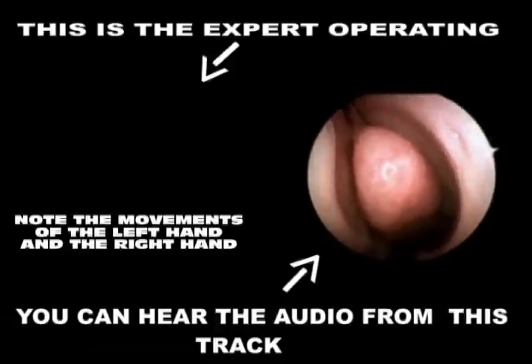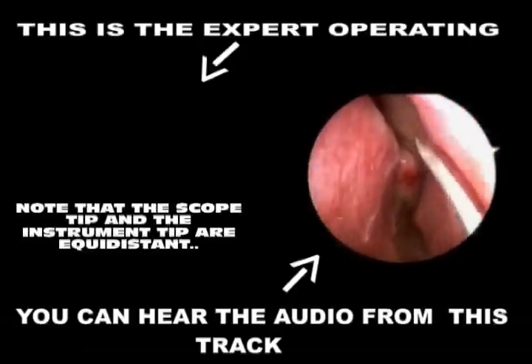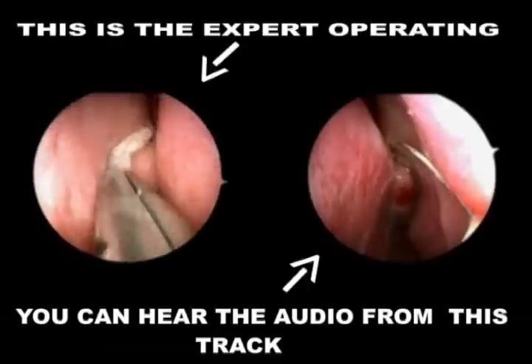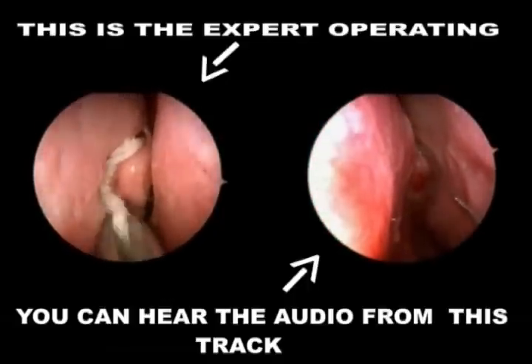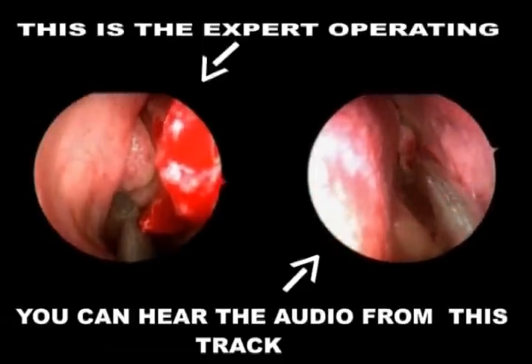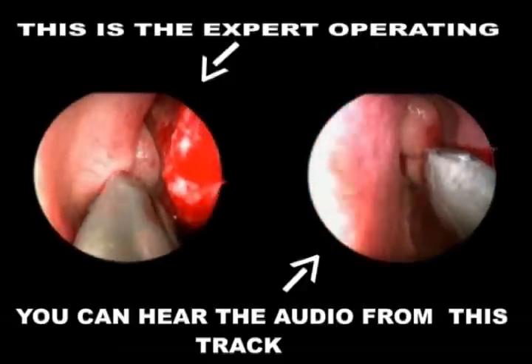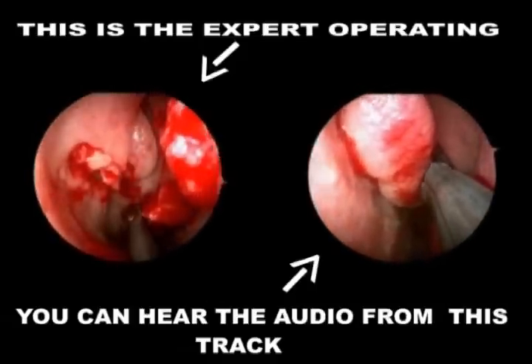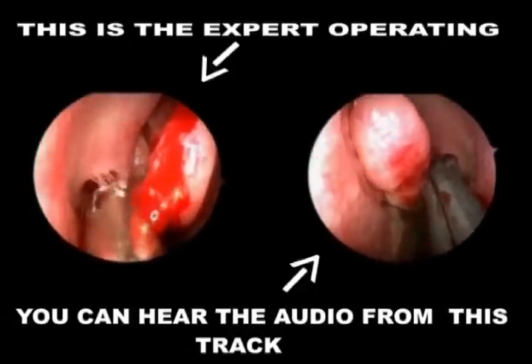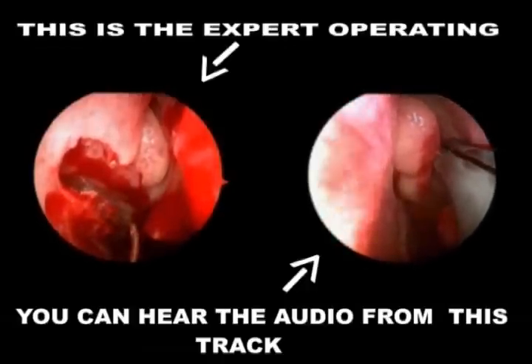Here is a first surgeon who has done just 20 middle meatal antrostomies. You can see the scope tip did not advance with the instrument. Now you can see the same surgeon infiltrating the nose — his right hand is wobbling, the left hand is also not steady and is far anterior. The left hand is not advancing as the right hand moves inside. Now the scope is too close, now too far. You can see the camera tilt, and the scope is viewing the natural ostium from below rather than from an aerial view — that is why the surgeon is not able to see the natural ostium.